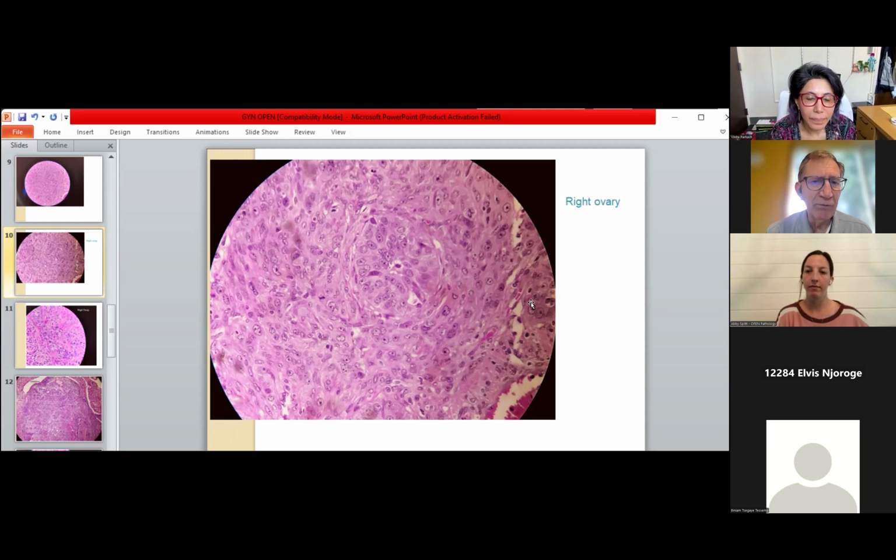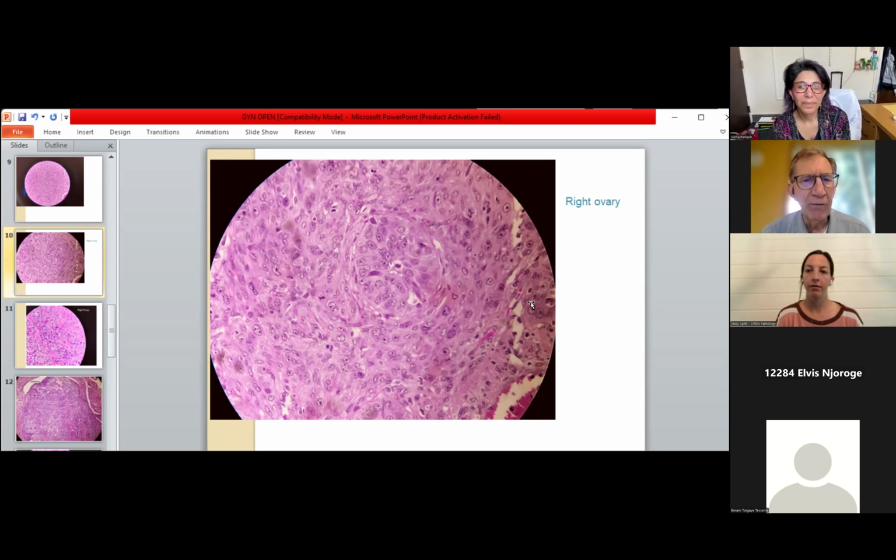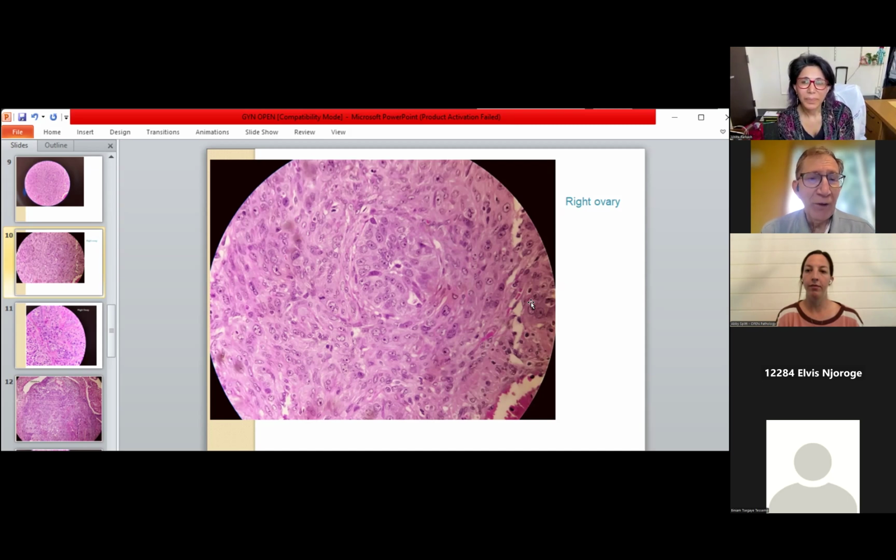And as far as the differential, Benita's right. The GI tract is a prime consideration, but more likely the solid GI tract rather than the tubular tract of colon or appendix or something of that sort. Right. So that's where the brown stains come into play.